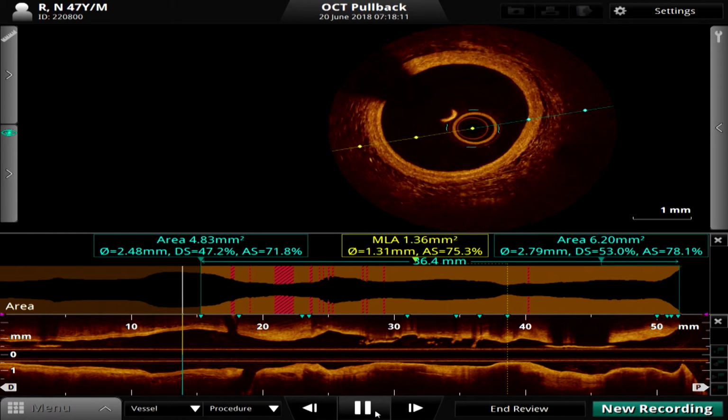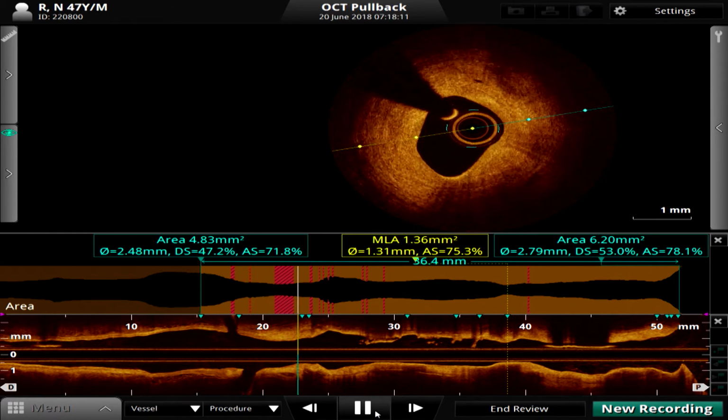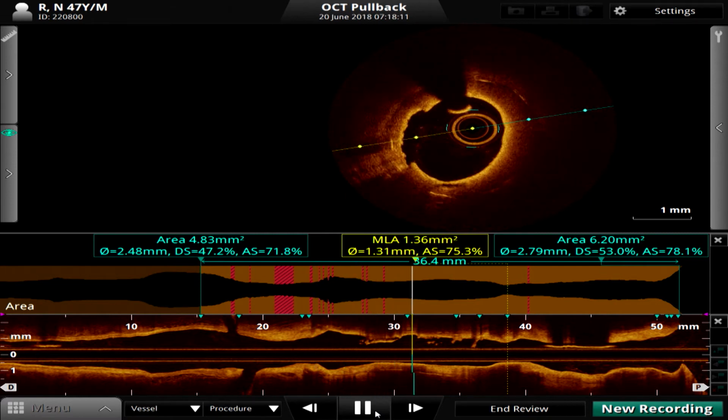Tom, any thoughts? No, I agree. You have to cover both the old stent and the tissue that's diseased on both proximal and distal stent margins. So yeah, I agree. Longer stent and PCI.